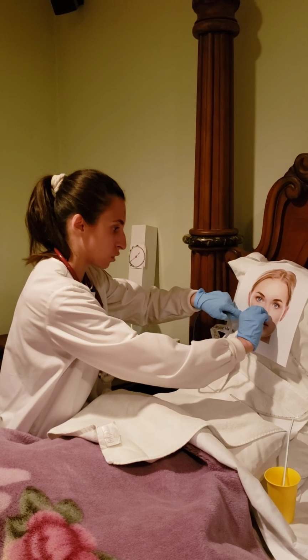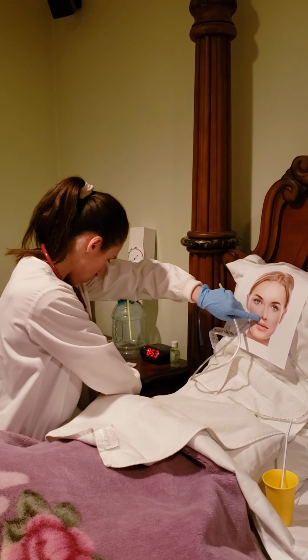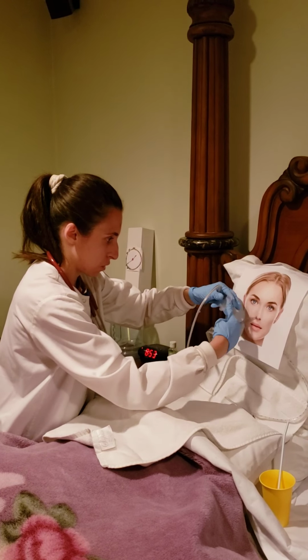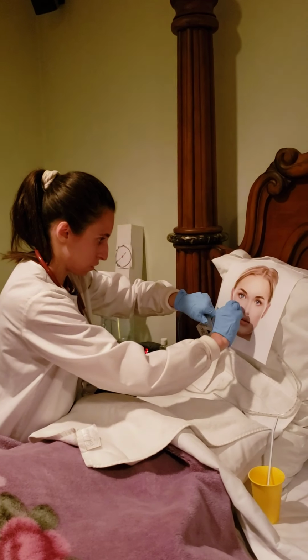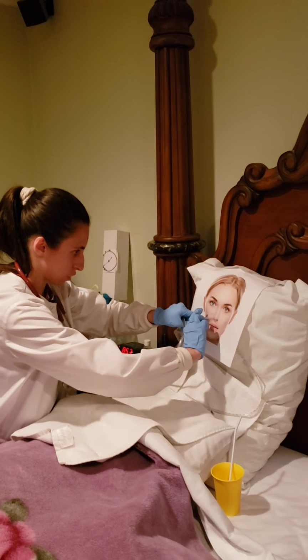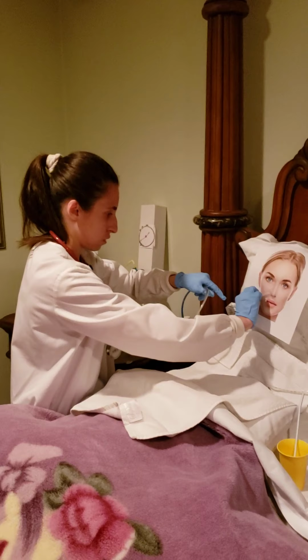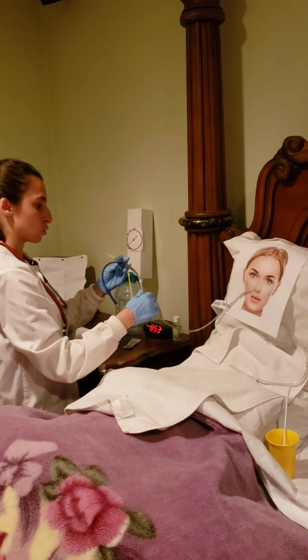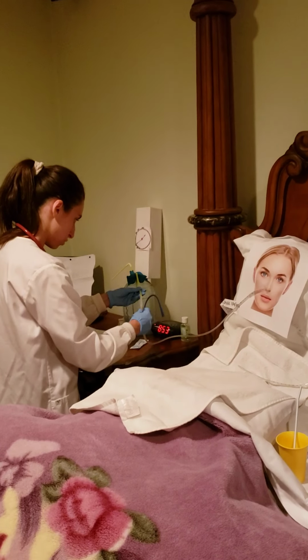So I'm now going to replace the tape with some more tape. Wrap it around for more stability. And now I'm going to attach the NG tube to the suction.